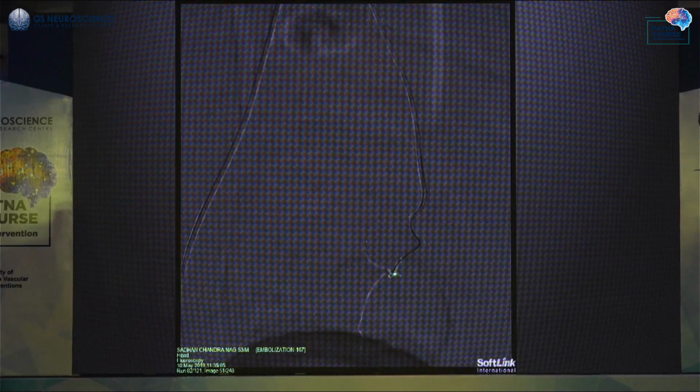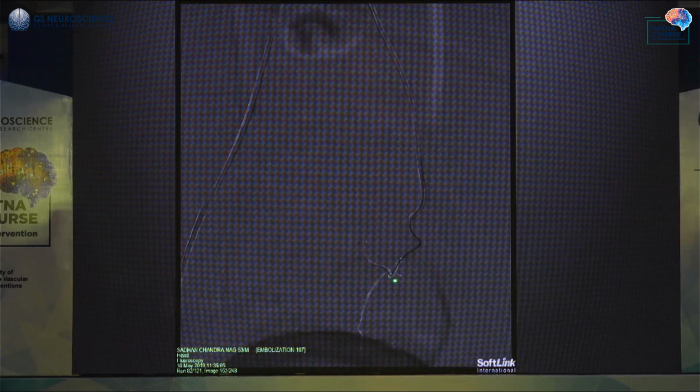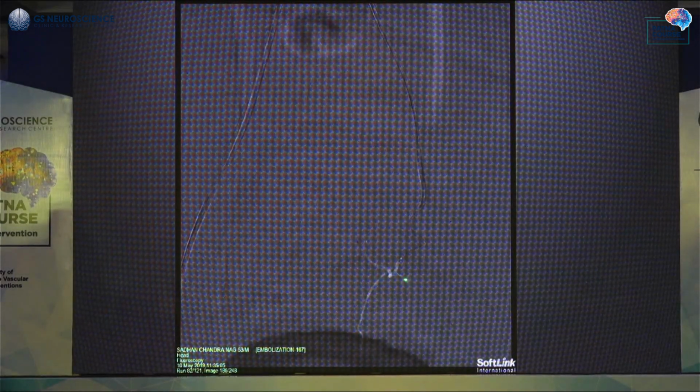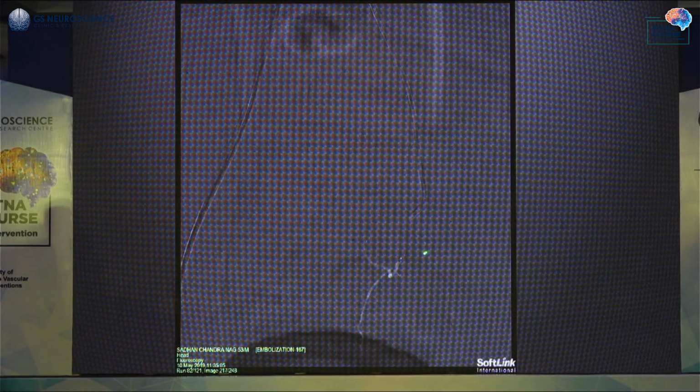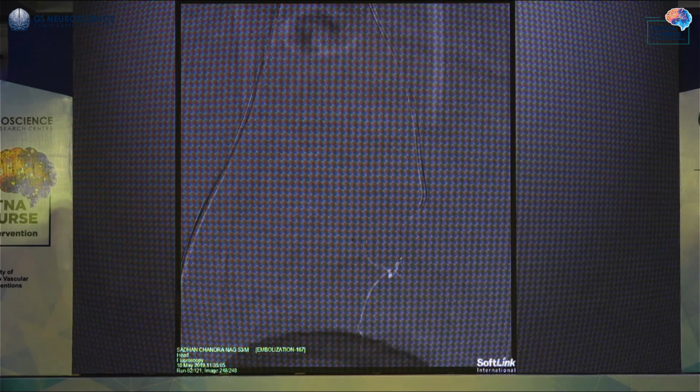My wire is here, my microcatheter is here, as you can see here. You're having a positive on the microcatheter climbs, the wire is only acting as a little accordion. At this curve, I'm just facilitating the microcatheter to move forward. Okay, it has climbed up there, still not enough. I need to go further.